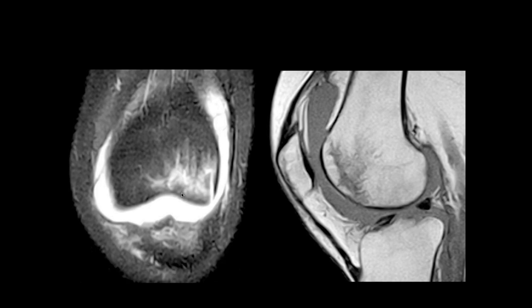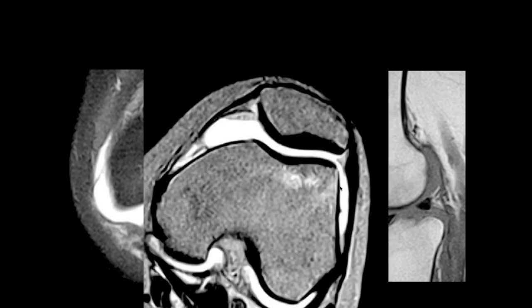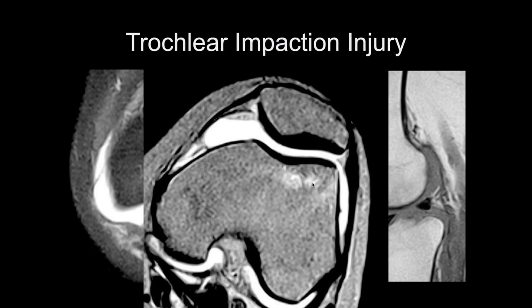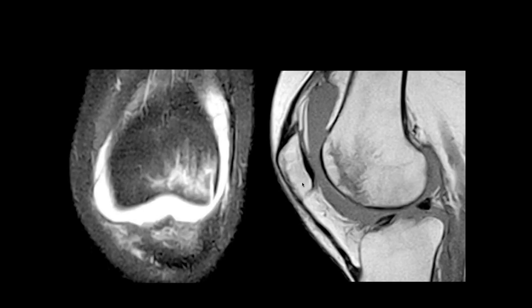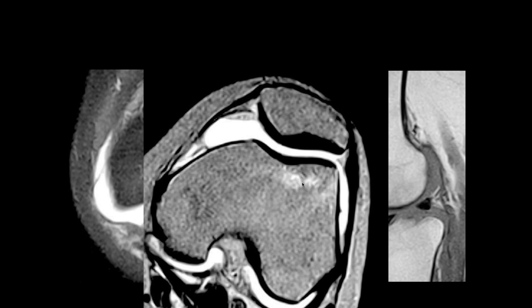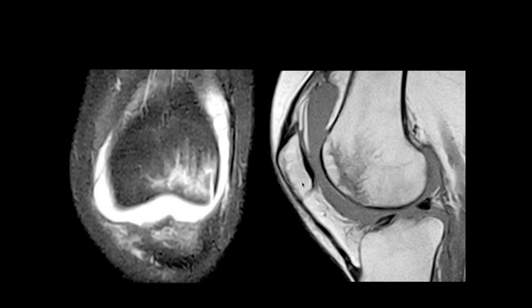There's a fracture through the lateral anterior part of the lateral femoral condyle — minimally displaced. The cartilage looks relatively spared — a subchondral type fracture. This is an impacted fracture by mechanism, really a subchondral fracture, one that will heal pretty nicely if you allow it to heal and don't impact the injury. This was a direct blow — a fall on the knee.